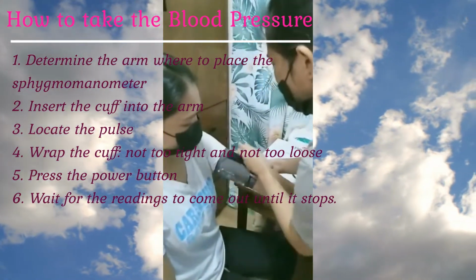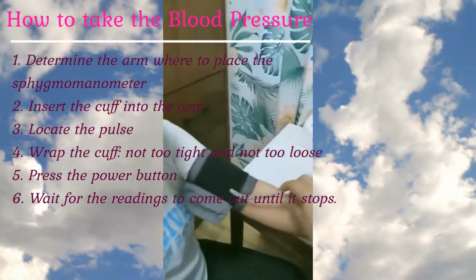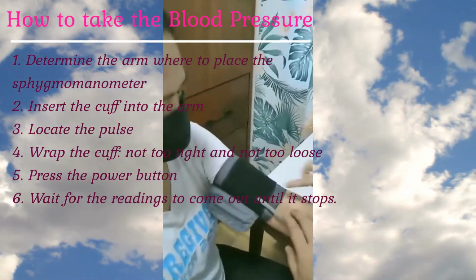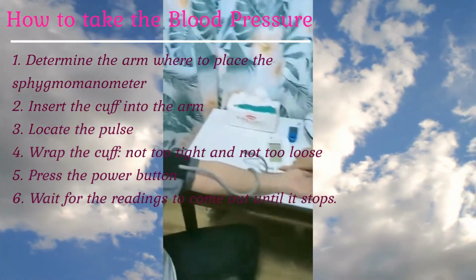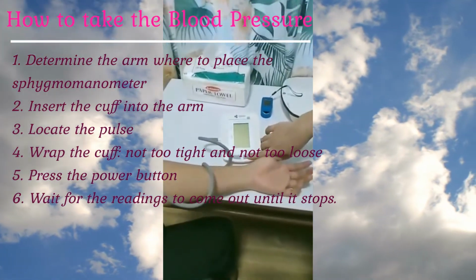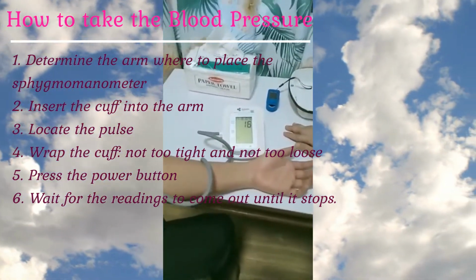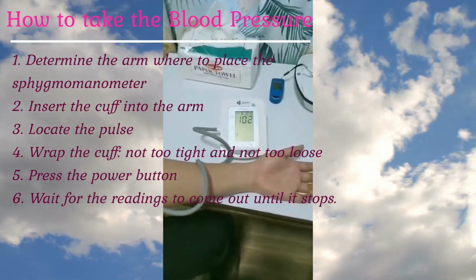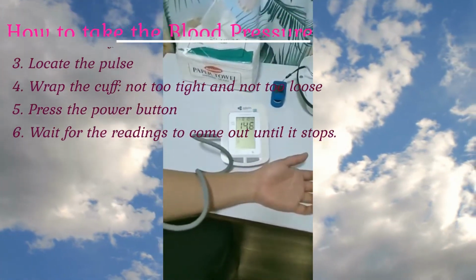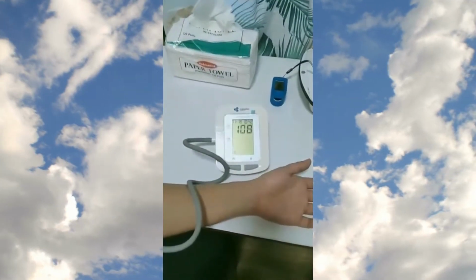Wrap it around, but see to it that this one is perpendicular to the artery. And put the machine on and wait for the reading to come out. Once it stops, that's the reading of the blood pressure.